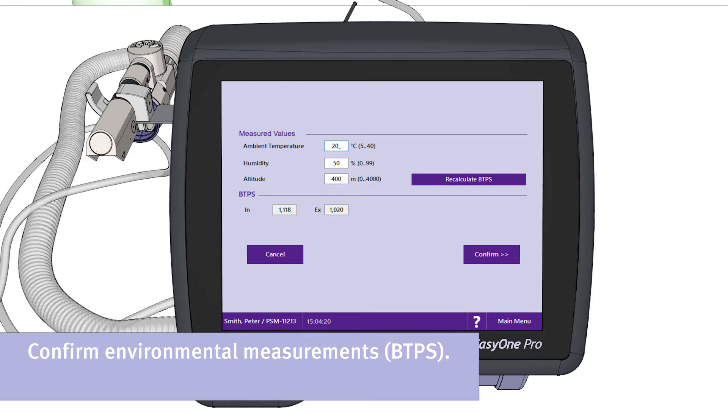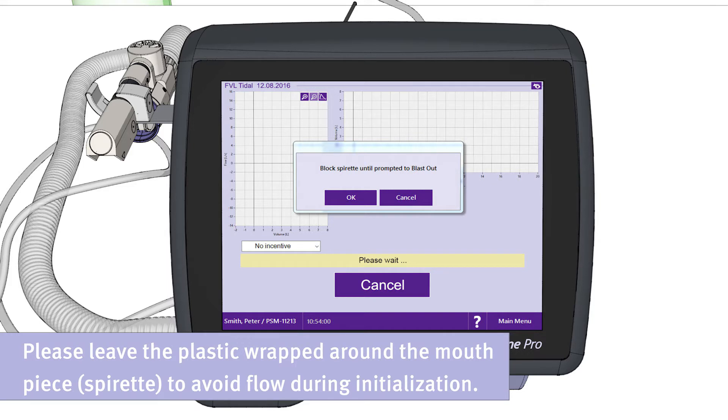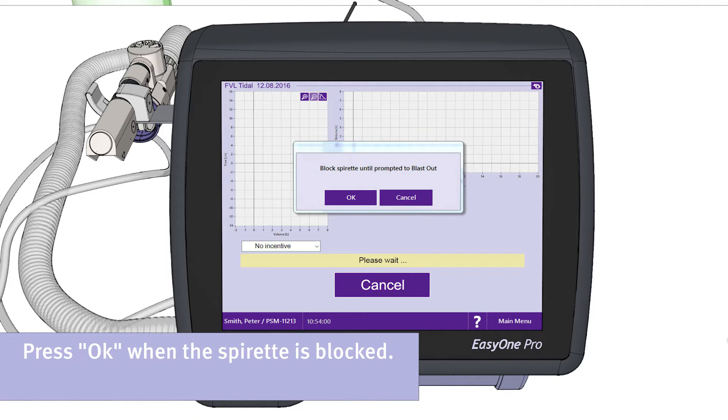The temperature, humidity, and altitude are automatically measured by the device. Leave the plastic wrapped around the mouthpiece to avoid flow during initialization. Press the button OK when the spirette is blocked.